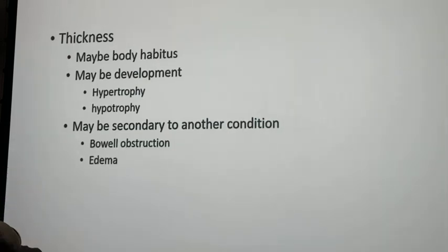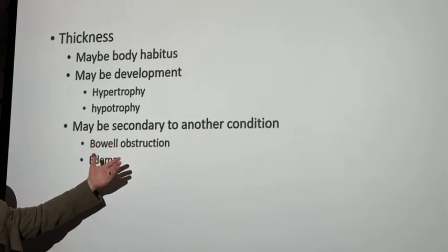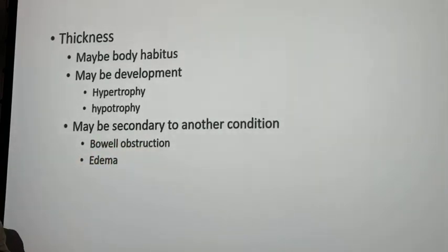So really what gives you that bulging belly is not fluid, but air, right? So in these cases, what do you do with your technique? Well, in one case, you've got to increase your technique. In the other case, you've got to decrease your technique, or at minimum, not increase your technique for a bowel obstruction.